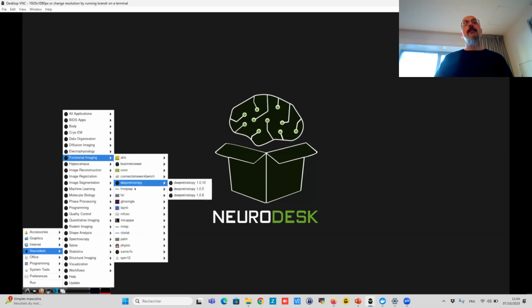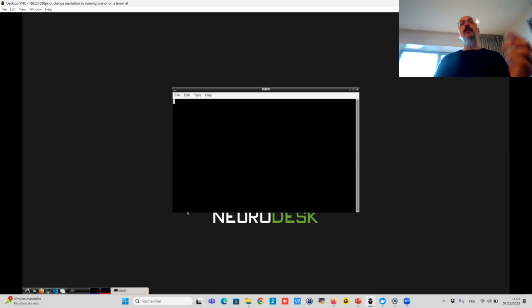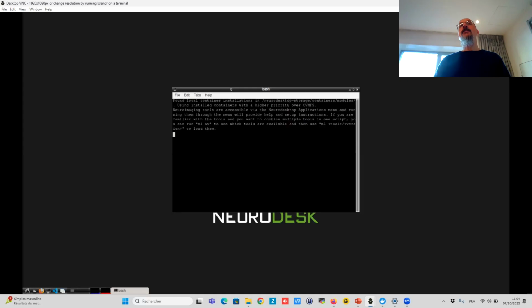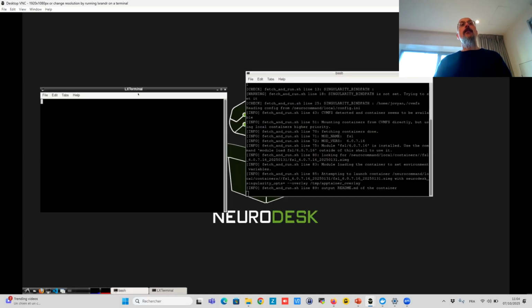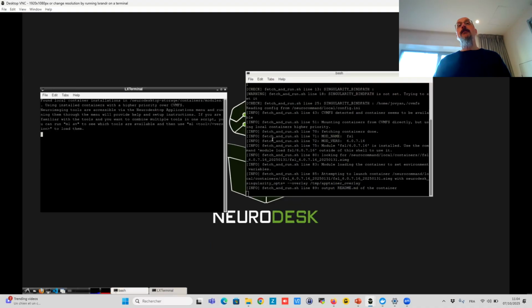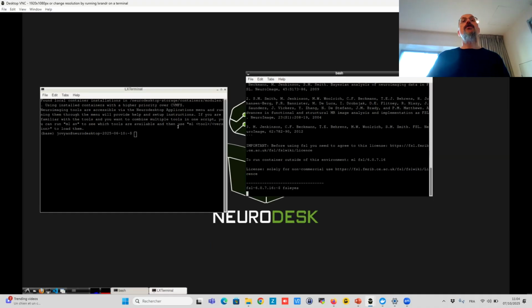We use FSL. There are different versions of FSL. You can use the recent one or the oldest one. You just need to click on it. It has a shell on it. It's Linux based, I think. So you can run it. Say I want to use FSLeyes. Normally it should open.